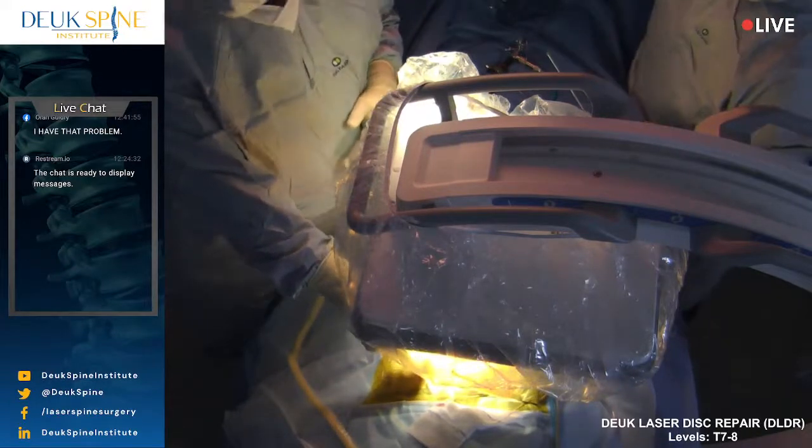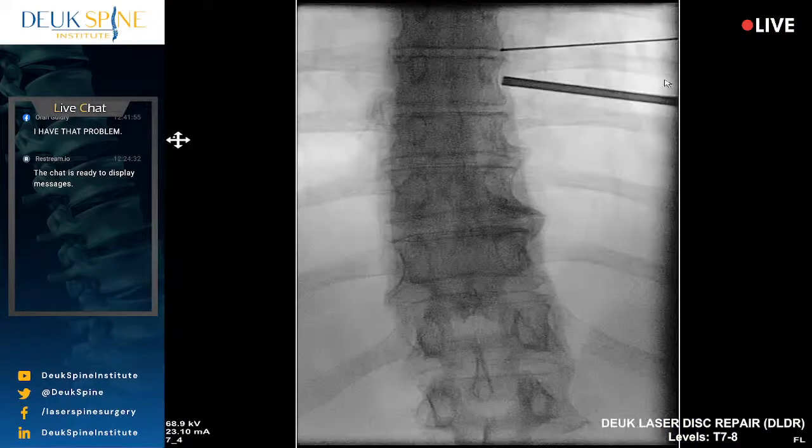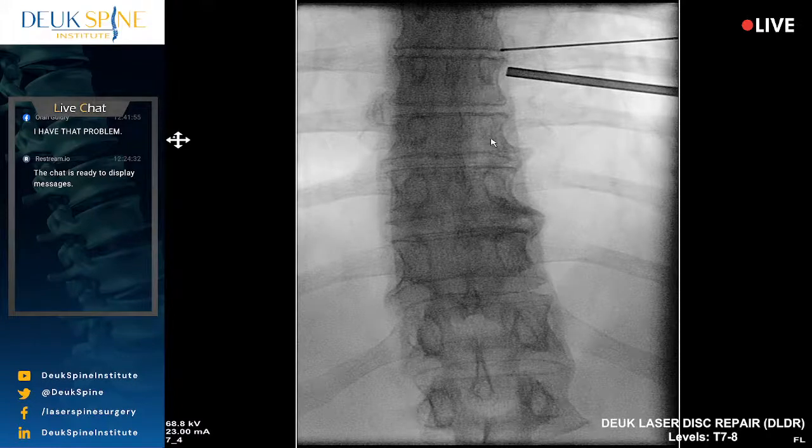Right there in front of this thing is the pedicle. Let me show shot. Yeah, okay, that's good. Perfect. Show them another pedicle down below. So that would be 9 pedicle, then go down to the next one, 10 pedicle, next one, 11 pedicle, next one, 12 pedicle. Show them the rib attaching to the pedicle there.